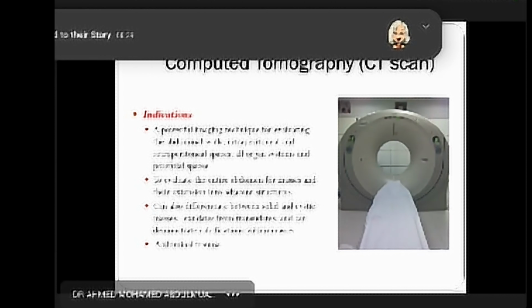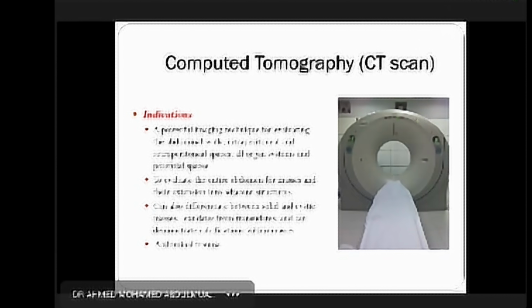And we have to monitor the patient. Then secondly, patient should be fasting before doing any CT scan with contrast. And then also we have to explain the procedure to the patient in detail regarding radiation dose and everything, what we are going to do for the patient. Then they take the consent from the patient. Then we also have to check the urea and creatinine should be within normal limit, okay?